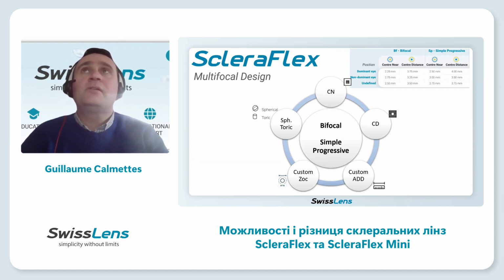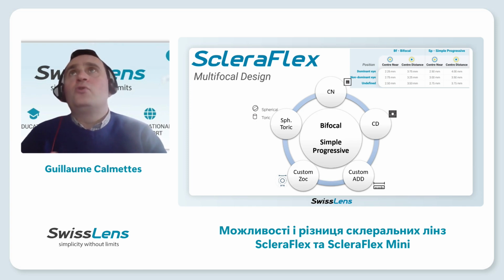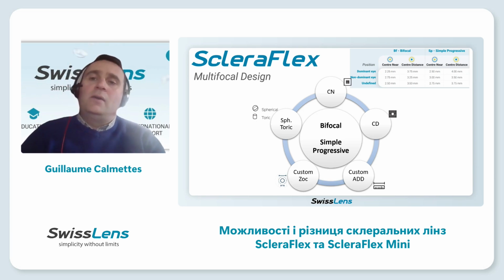For sure, it could be toric with cylinder up to -8. You have the option to choose between center distance and center near, depending on which customer you want to fit. In my opinion, it's better to start with center distance, but it's also possible to order center near.